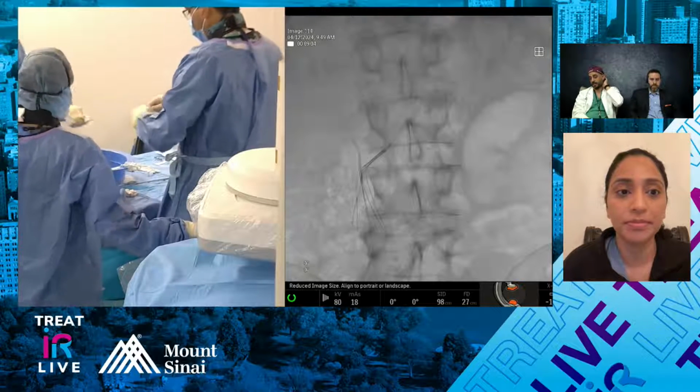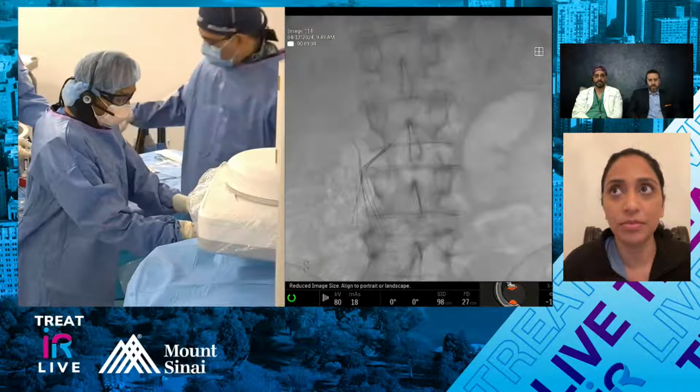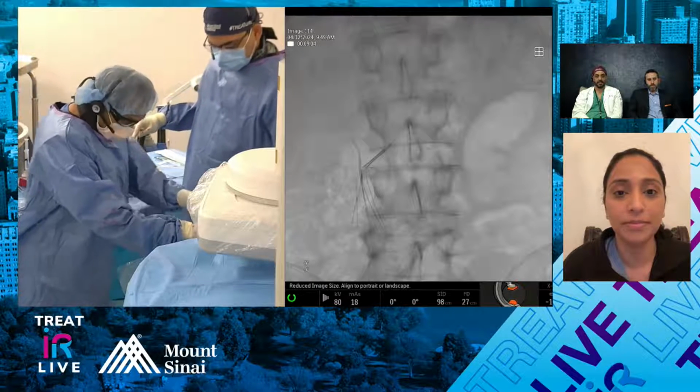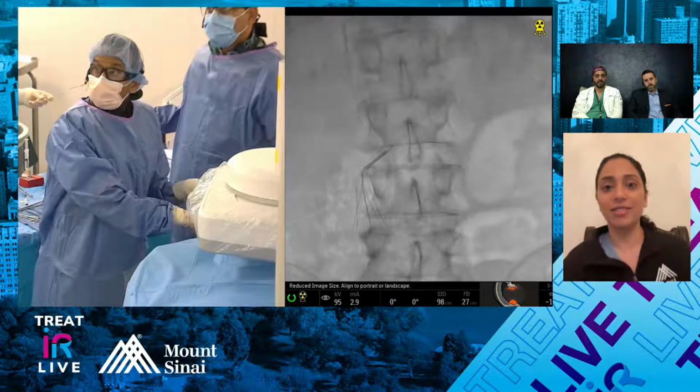Yeah, my concern with the DrySeal, obviously when you put the 16 French through, is that you're going to tear the valve coming through, and then it just becomes a mess. Yeah. Well, I think that's a good point.